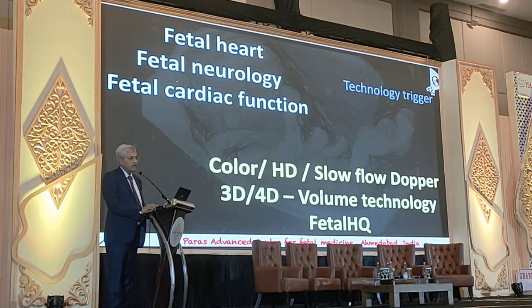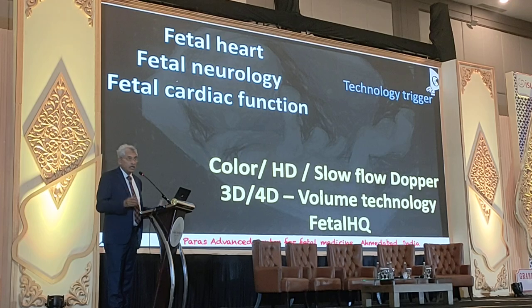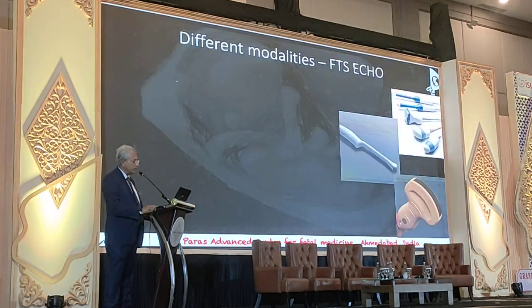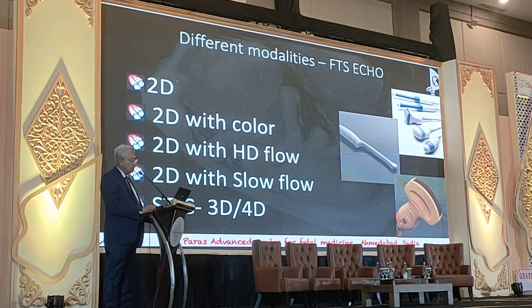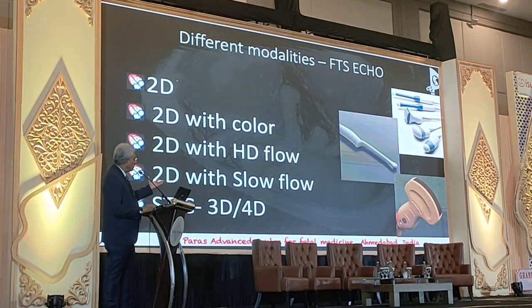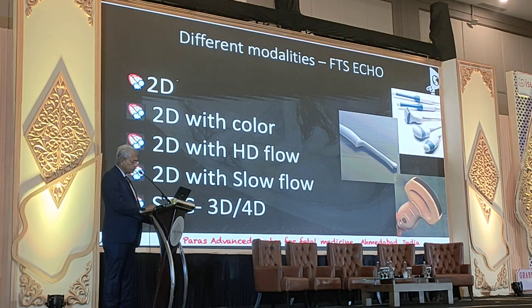Unlike the fetal brain, the brain changes at 12 weeks, at 14 weeks, at 18 weeks, at 30 weeks. Here the heart remains the same. That's the advantage for the fetal heart, so you should be evaluating like that. To do that, you have many options and you can choose. Many probes and superb quality instruments are available, along with ultrasound techniques, and that's how you should evaluate those fetal hearts very easily.